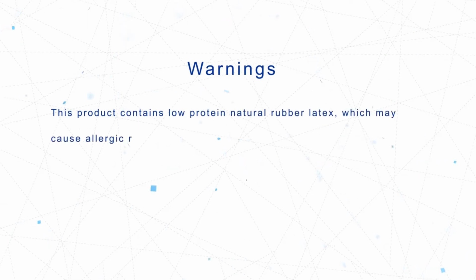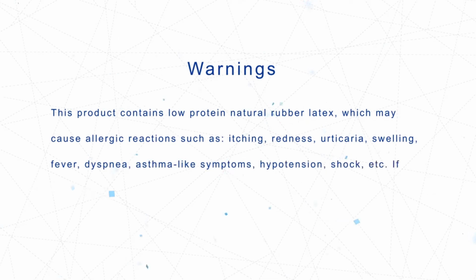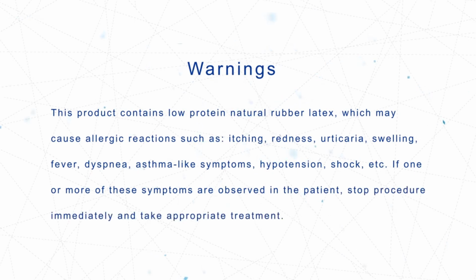Warnings. This product contains low-protein natural rubber latex, which may cause allergic reactions such as itching, redness, urticaria, swelling, fever, dyspnea, asthma-like symptoms, hypotension, shock, etc. If one or more of these symptoms are observed in the patient, stop the procedure immediately and take appropriate treatment.